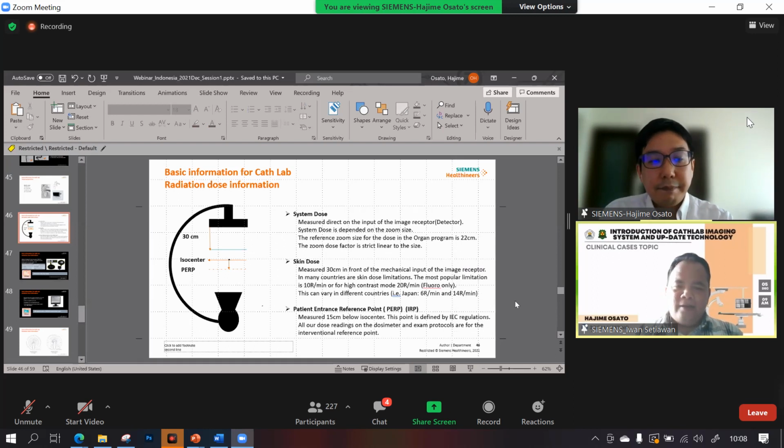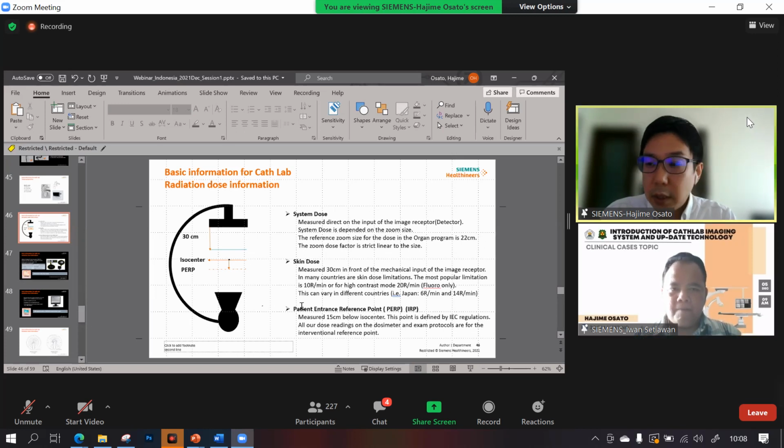Okay. Yeah. I think the next question is related to your slide, Mr. Hajime. The question is, how are both DAP, dose area product, and air kerma measured by the system? Yeah. Thank you for a nice question.